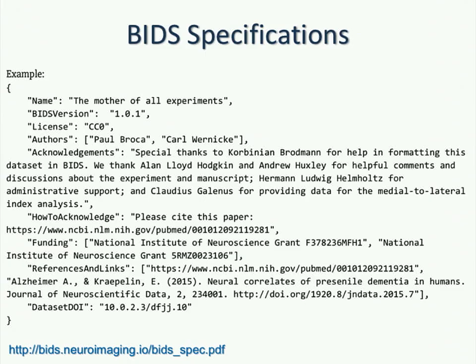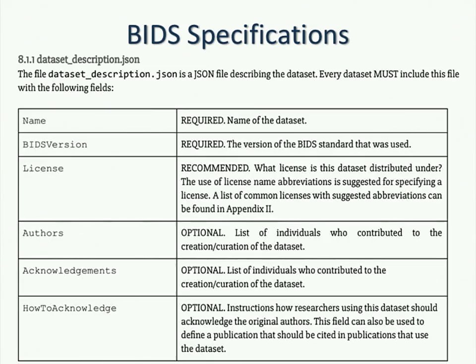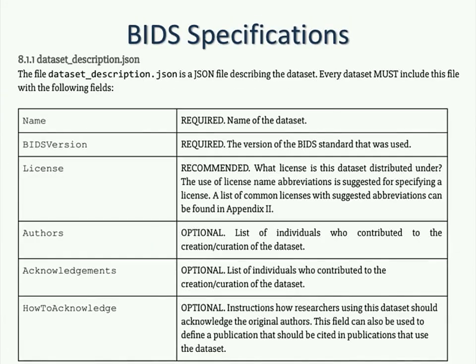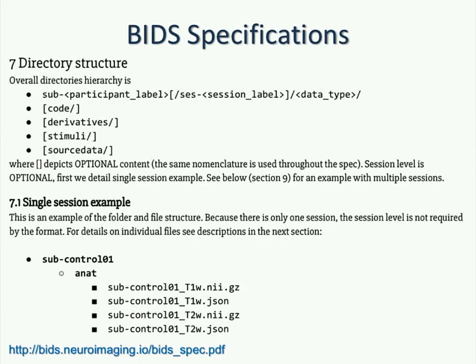And as I said, the main thing that we're going to deal with today is the directory structure, which, in the slides, that was right here, right? So that you have a standard way to name the subjects. All we're dealing with today is anatomical scans, so you'll have something very similar.